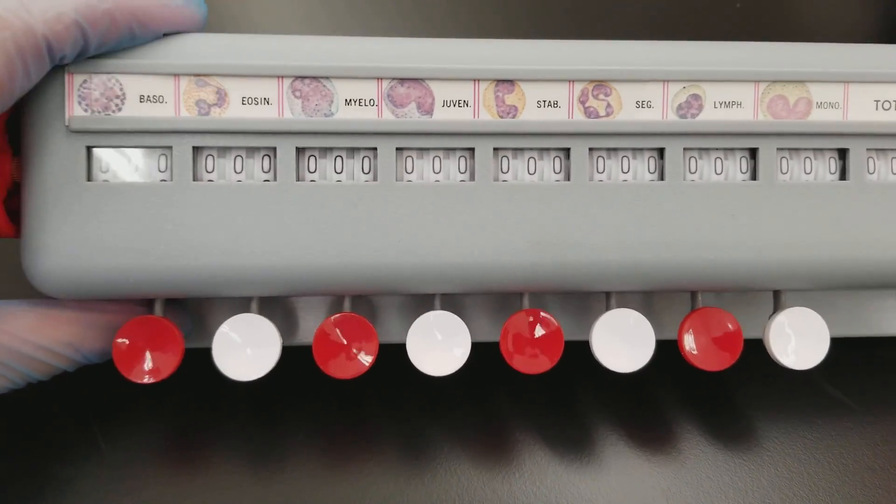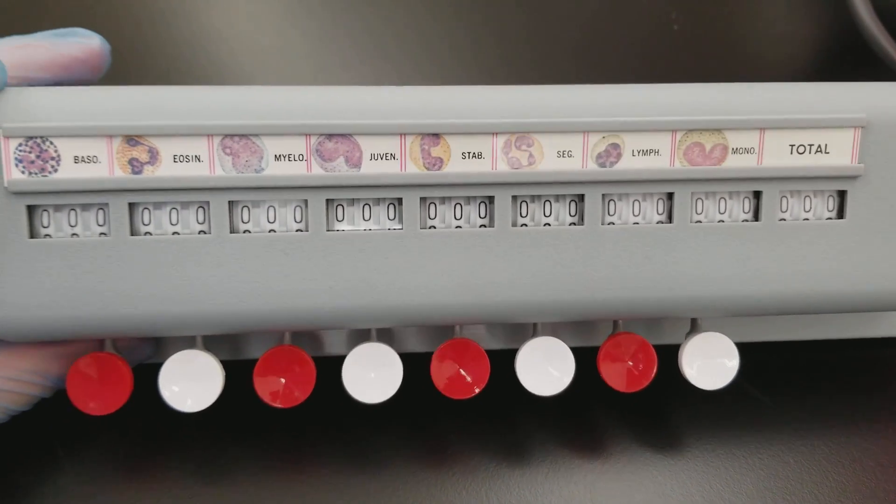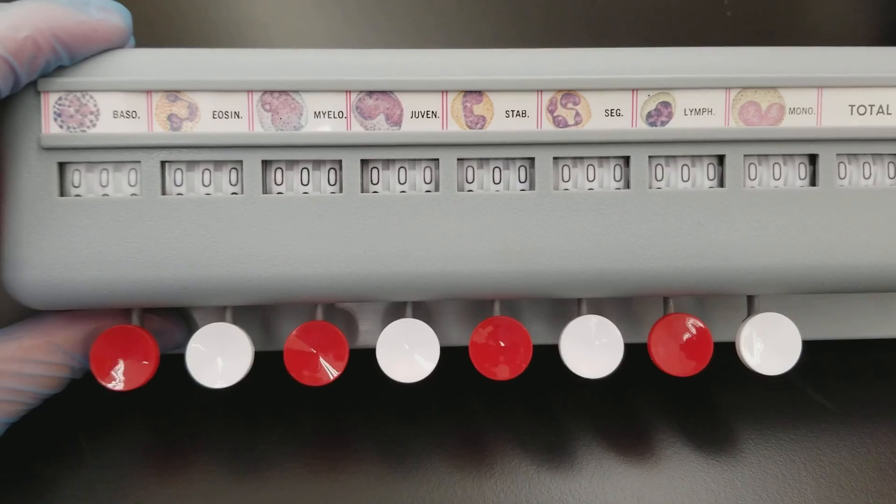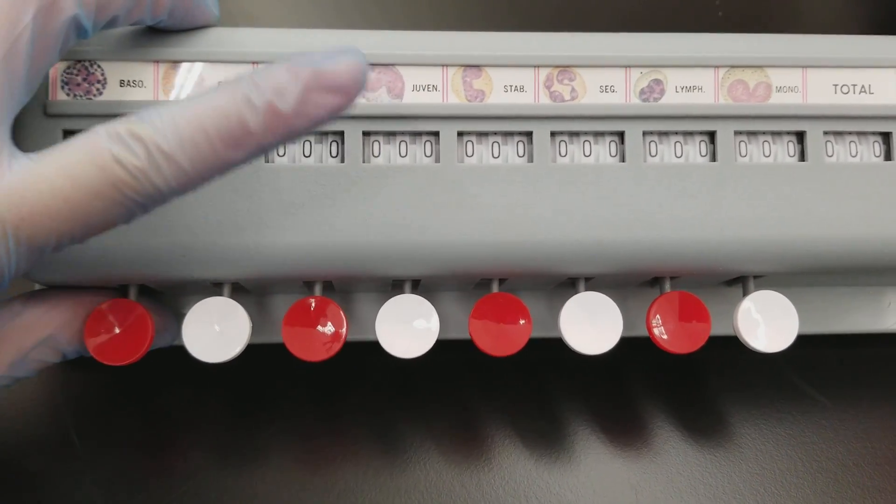So these basically are indications of cells that you're going to see possibly on the smear. But you can make any of these be whatever you want.